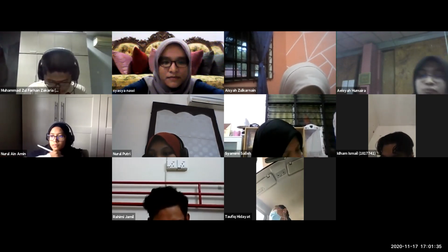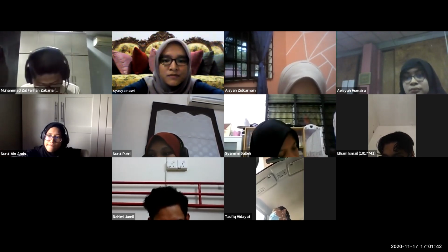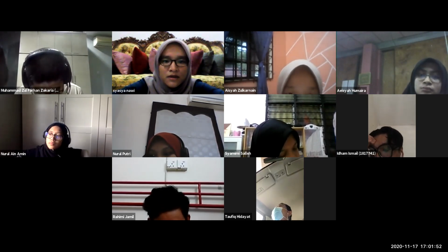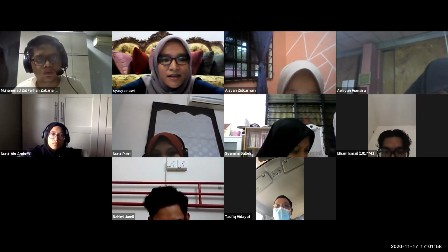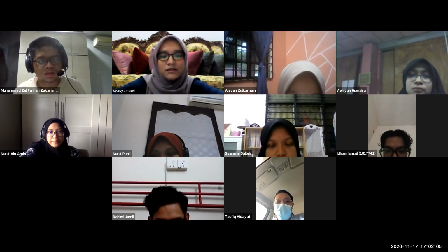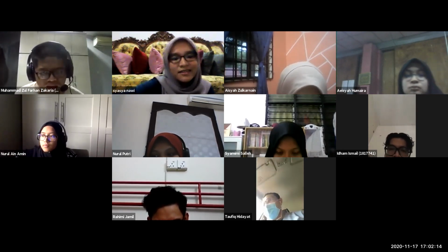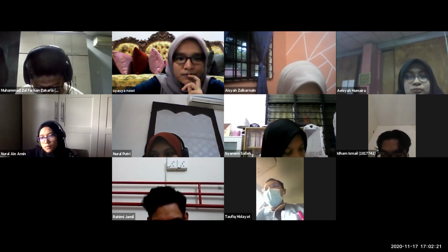And this is only for fluid and usually for medication, but let's say you need a blood transfusion, you also need a bigger size. If possible, the grey one. Is the grey one 20 or 18? The grey is 16. Oh, 16 is the biggest. Usually for blood transfusion, but for a bigger child, for a baby you surely can't get it in. For a baby, usually the yellow or blue one works.